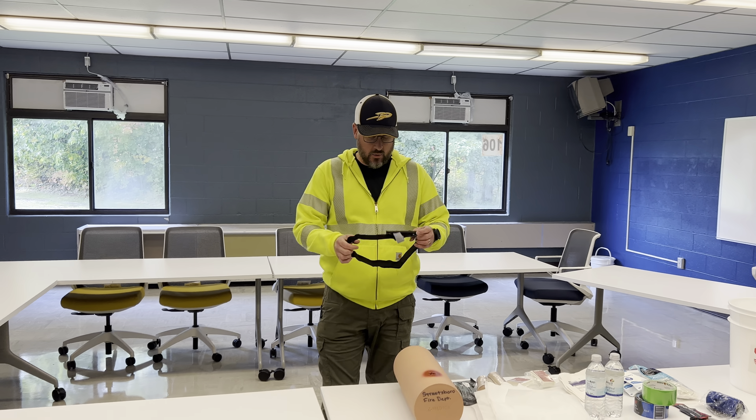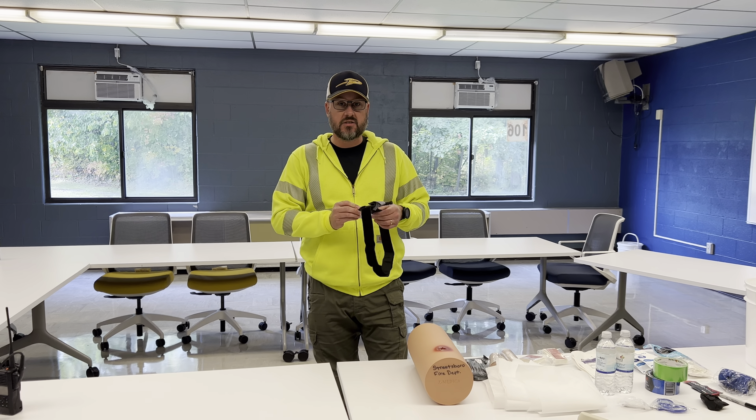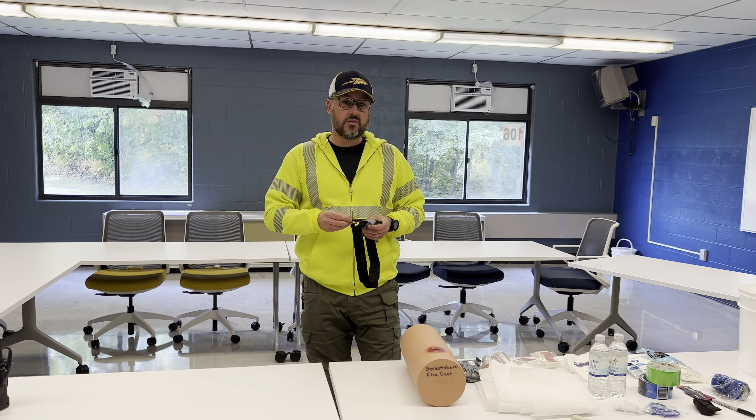Welcome back. We're going to chat about the tourniquet — how to apply it for life-saving purposes. We apply a tourniquet not for minor bleeding, but specifically for arterial bleeding: that bright red blood that spurts out of a wound. In this case we're going to use a demo arm and leg component instead of applying it on ourselves, but you can certainly do that.